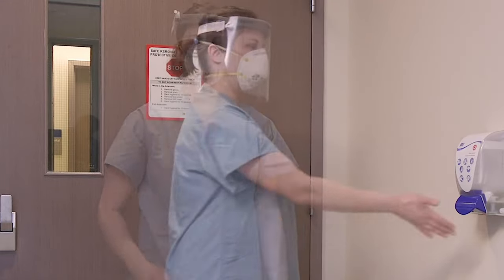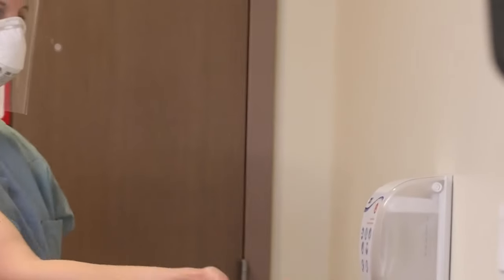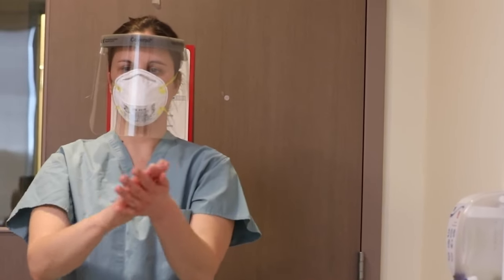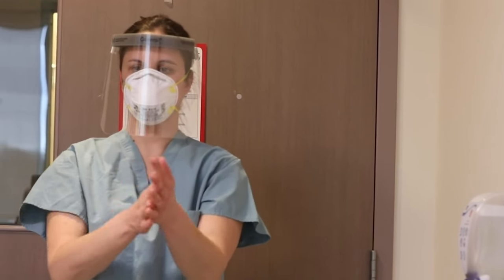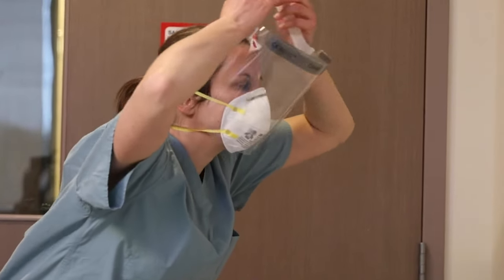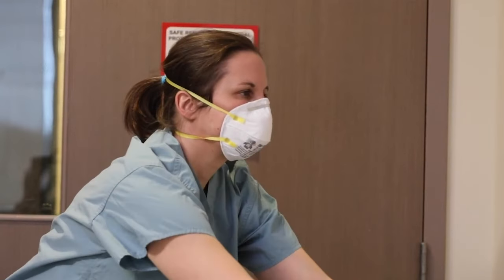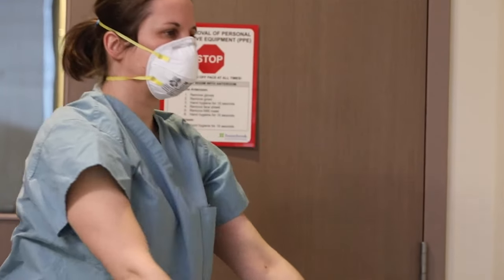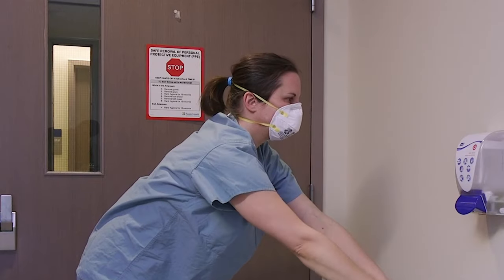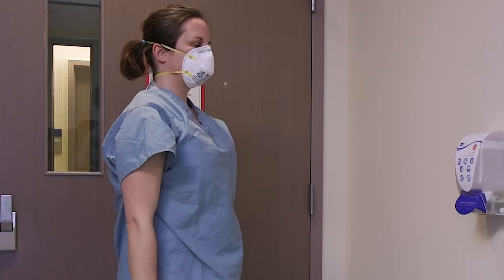Perform hand hygiene for 15 seconds. Remove the face shield by grabbing the strap at the back of your head. Slowly remove it down and away from your face using the sniff position — bend forward, eyes forward, chin out. Dispose of the face shield into the garbage.